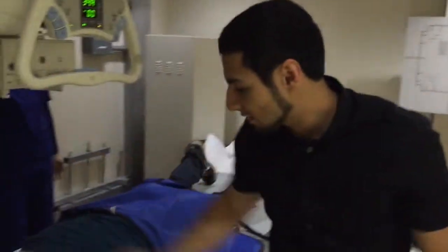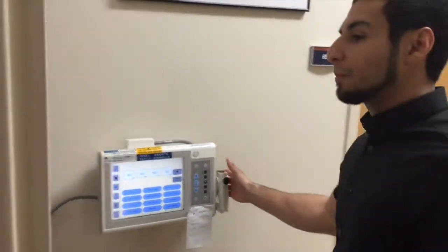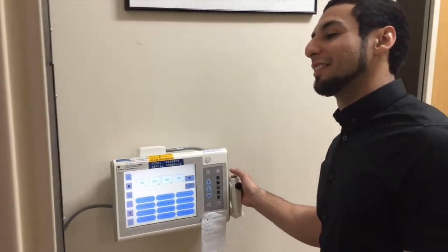Alright, sir, remain perfectly still, okay? Okay. Hold your breath.